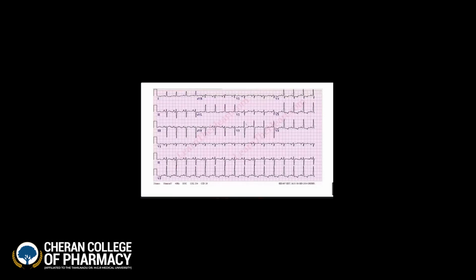While interpreting an ECG, it is not always the case that the R wave falls exactly at the midline. So always go for the accurate method. That is my suggestion, and everyone does that. Whenever you check an ECG, don't just follow the heart rate written on the ECG, because sometimes the result might be negative.